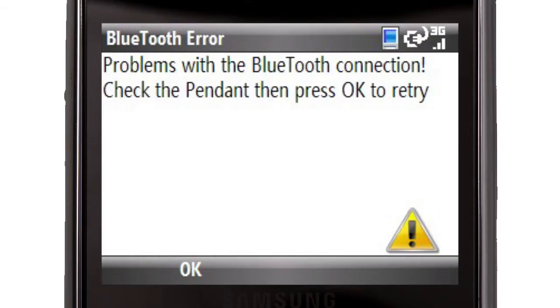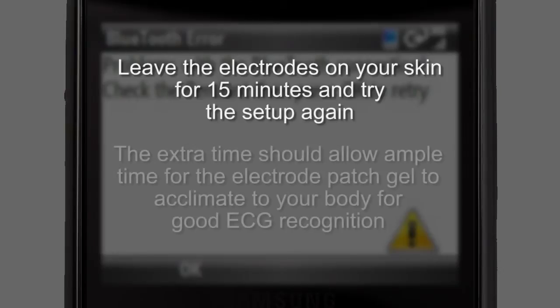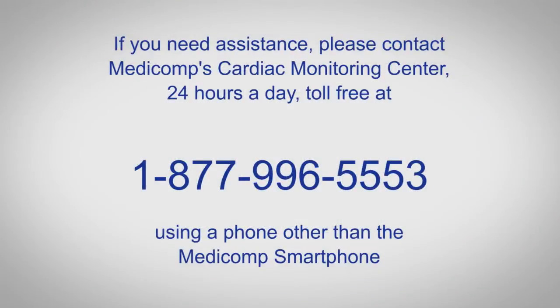If you see something other than monitoring, leave the electrodes on your skin for 15 minutes and try the setup again. The extra time should allow ample time for the electrode patch gel to acclimate to your body for good ECG recognition. If you need assistance, please contact MediComp's Cardiac Monitoring Center 24 hours a day, toll free at 1-877-996-5553.